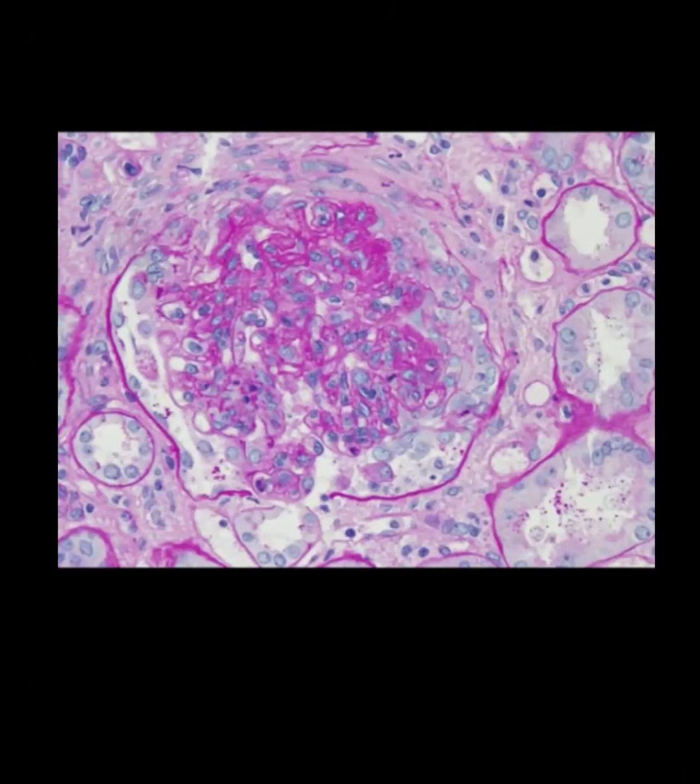Just as we call CT with contrast or MRI with contrast, PAS is actually H and E stain with the contrast. So this is just a simple rule. If you are highlighting almost all the structures, that is the GBM, the TBM, the mesangium, the capillary loops, the single best stain I personally love is this PAS stain.